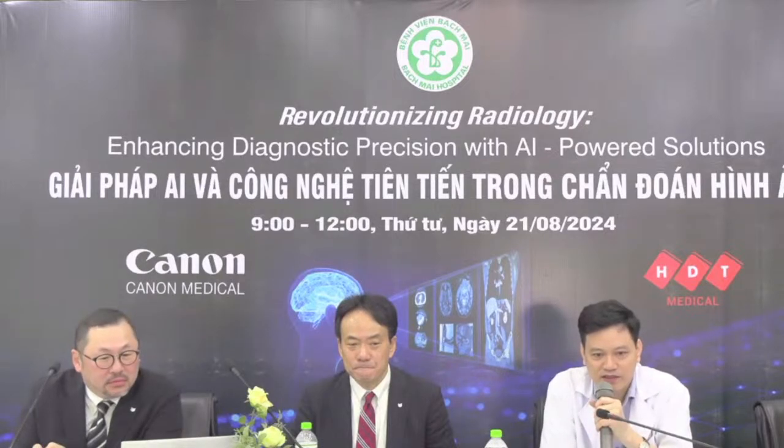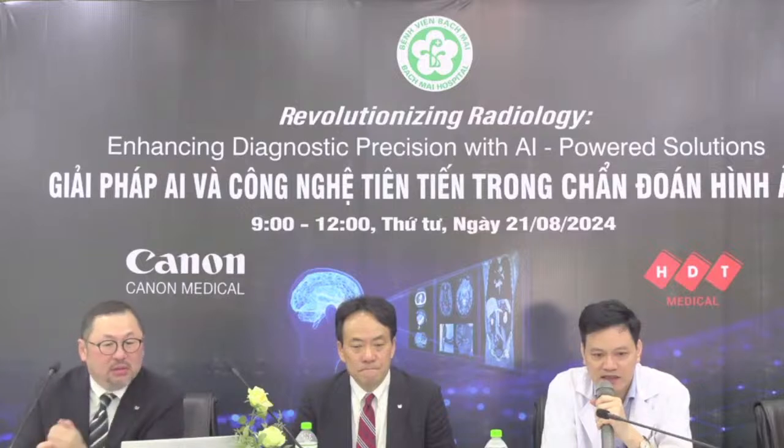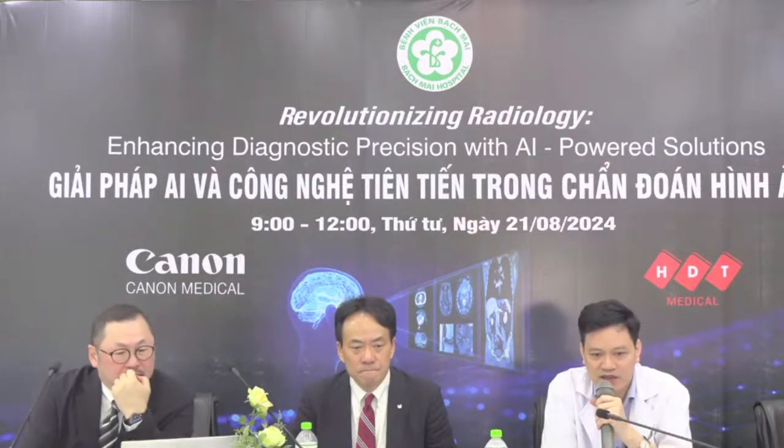Thank you. And the second question for Dr. John Ho is that the estimated coverage of photon counting of Siemens is only 2.4 cm in the ultra high resolution mode. So how many beats can it scan for the whole heart image? It's very careful to manage the heart rate, please. Yes, that's why you have to have very low heart rate. Otherwise, you get a lot of artifacts.